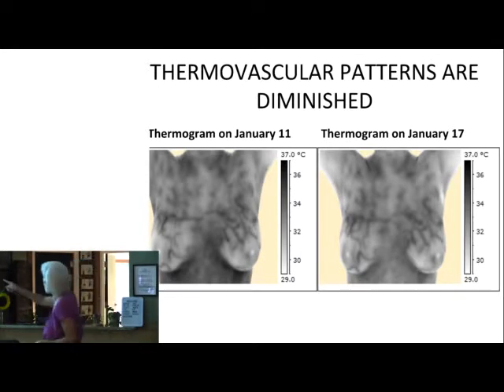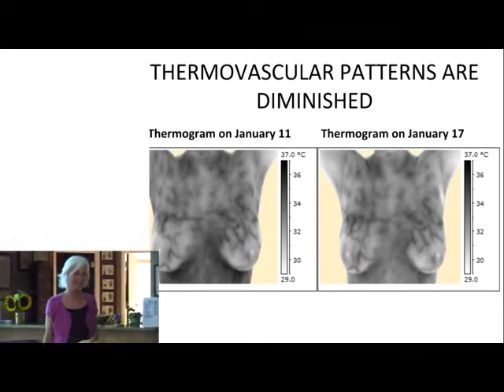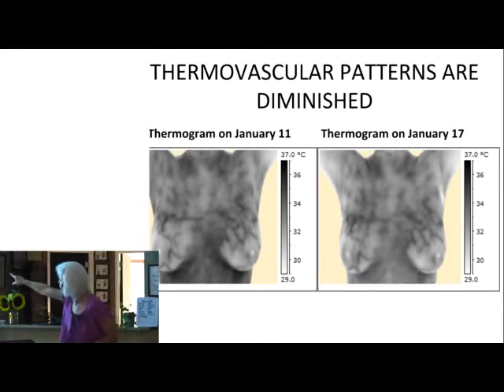But see all of her patterns here on her breast and the loops and so forth? We don't want to see that. These are not healthy breasts. She has a lot of patterns that are indicative that stuff's going on, that she's at high risk. But at least when they start to dim, and that's what they did in 1 week, well, we want them to go away. We don't want them to just dim. And with enough work, you can get those to go away. That vascularity, those patterns, the loops will start to unloop and they'll dim more and more, and that's how we see improvement.